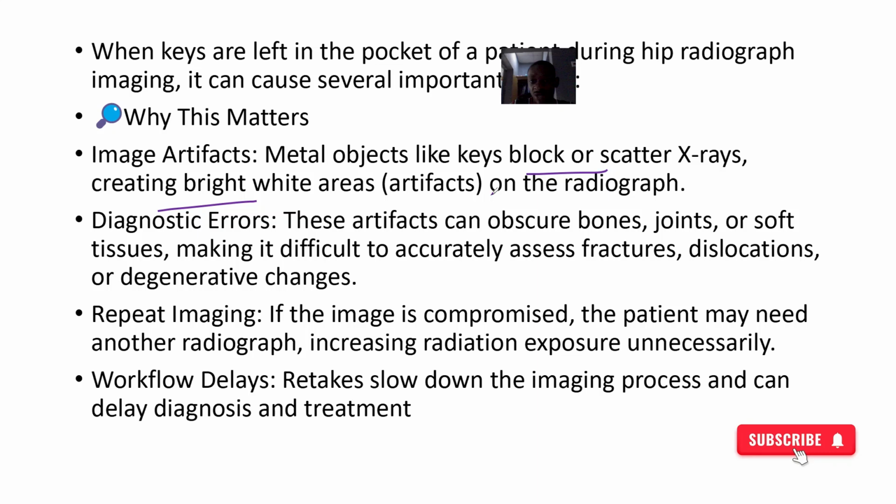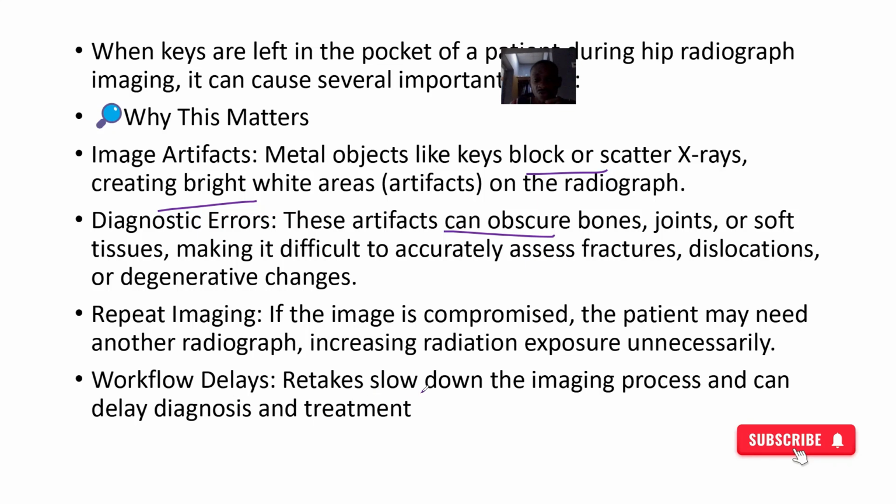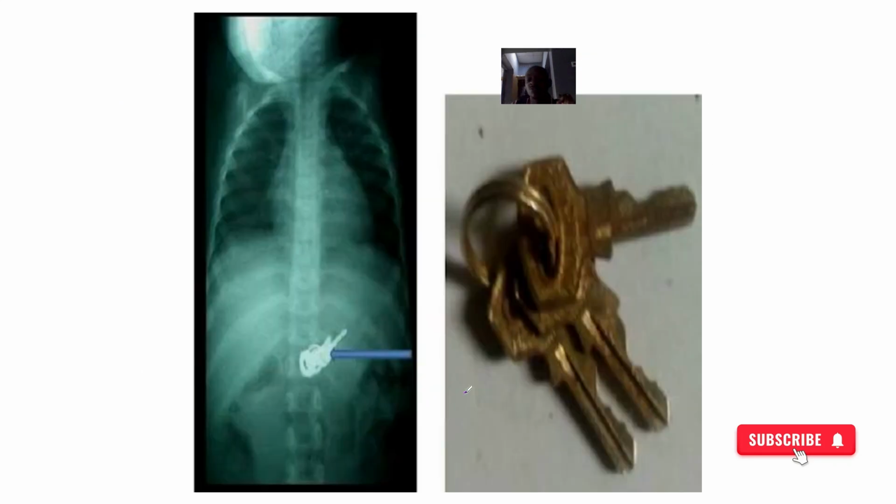Then diagnostic errors too. The keys could actually block the underlying joint and the underlying soft tissue. So even if there's a pathology there, the person reading it will not be able to pick it up quickly. Then it will lead to repeated imaging. Of course, the imaging will not be good, so they will always want to do it again. All right. Then workflow delay. Retakes slow down the imaging process and can delay the diagnosis and also delay the treatment. You see this person too left keys in their pocket.